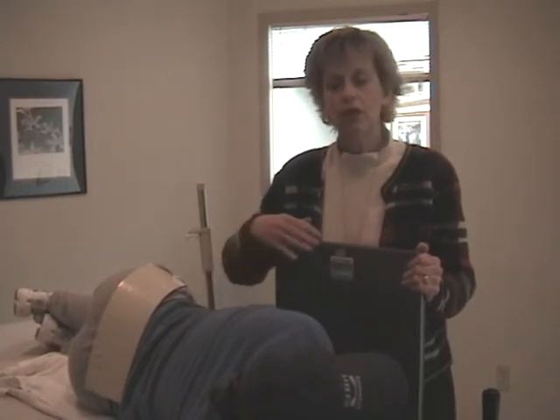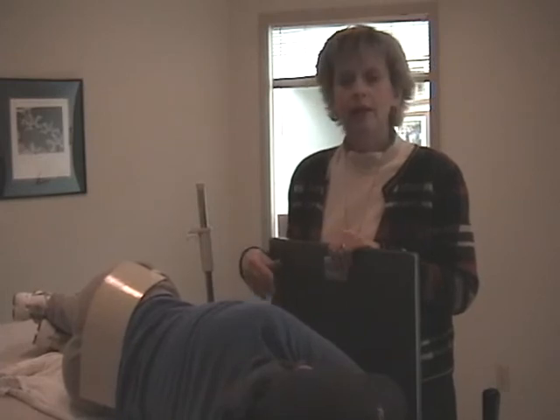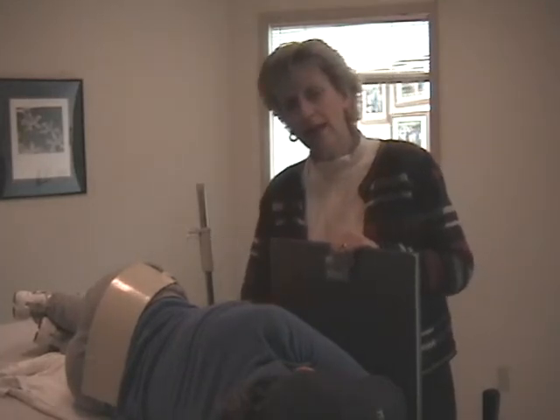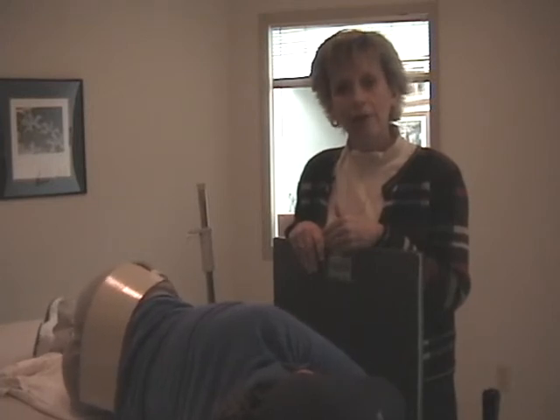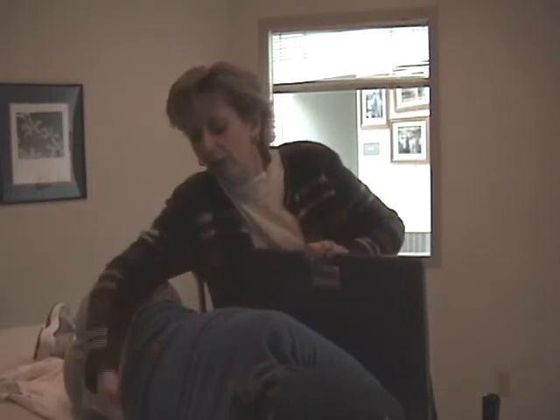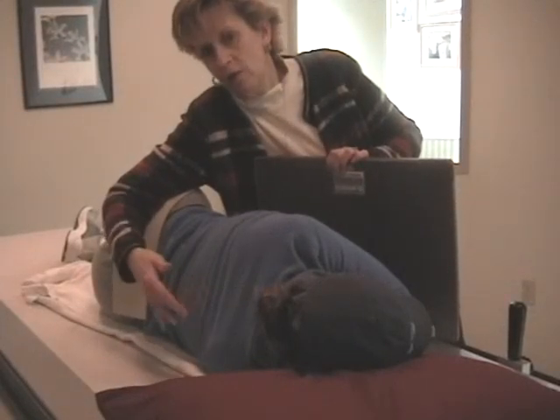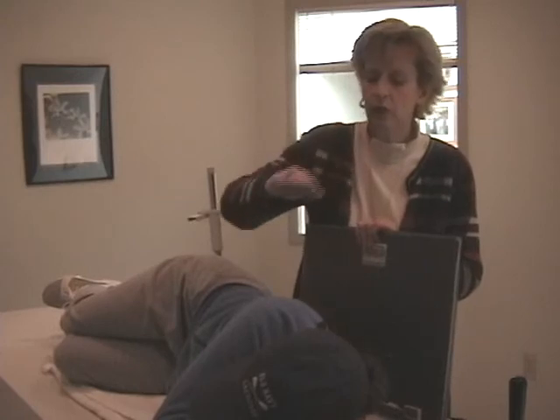If fluid was of interest, I want you to think about this for a minute. Fluid settles and air rises. I am interested in this scenario in a right side condition, and fluid, I put the right side down. If I was concerned about right side pathology and I was concerned about demonstrating air, what lateral would you take, keeping in mind that air rises? If I did a right side for air, the air would rise like this, be trapped by the pleural cavity, and air would be obscured by the spine. So if I was doing a right side for air, I would actually have to do a patient in a left lateral position because I'm after the right side, and air would rise and the spine would not obscure it in that way.